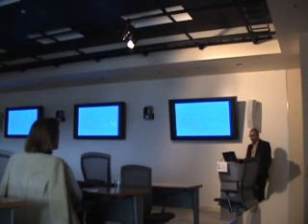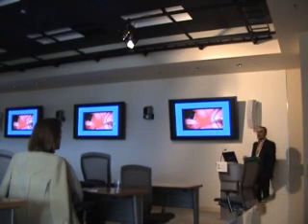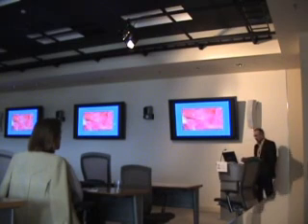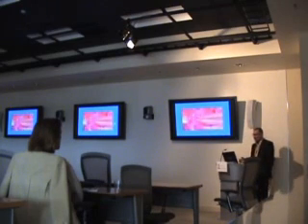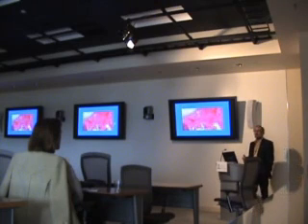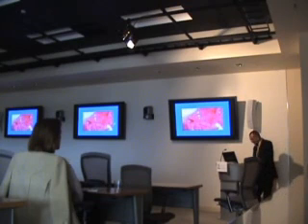Now, since 2002, one application of the model we use is to practice how to deal with the complication of intraoperative rupture of an aneurysm. And I bet most of you will spend the whole residency without even seeing an intraoperative rupture of an aneurysm. So this is the perfect model to practice such a complication that might happen to any one of us. It's better a thousand times to face this complication in a cadaver rather than facing it for the first time in a live patient.